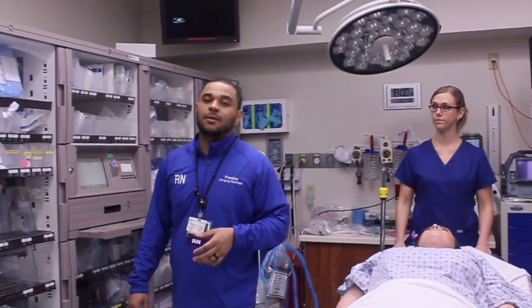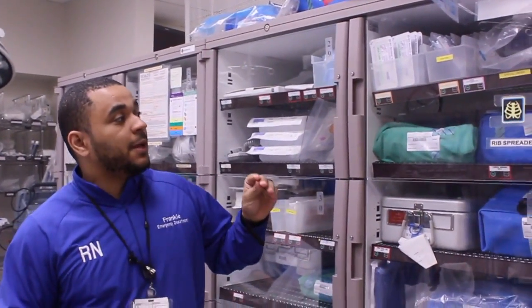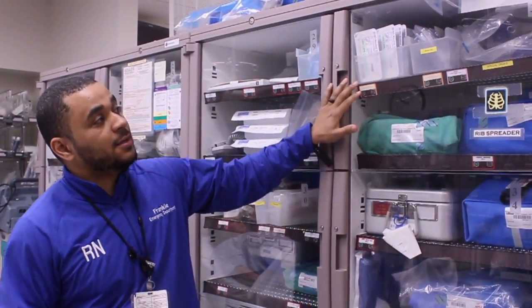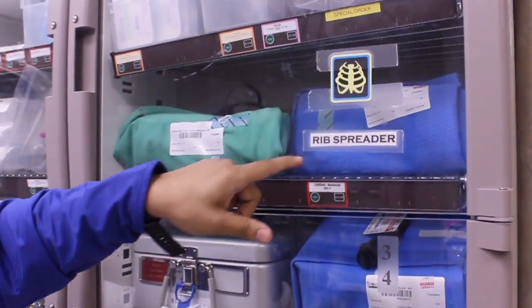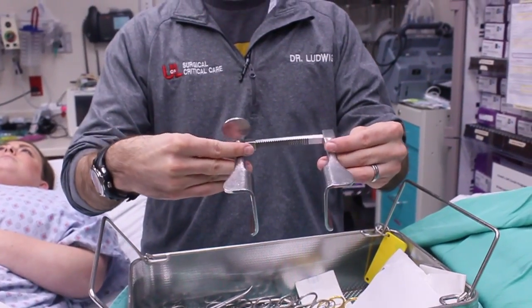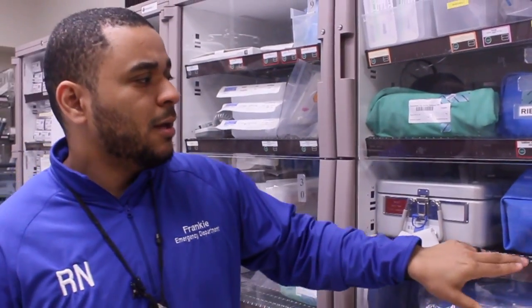Once the ED thoracotomy has been indicated by the physician, it's important that all PPE should be applied prior to initiation. The betadine and the suction Yankauer should be readily available at the head of the bed in case they encounter blood upon entering the thoracic cavity. The most important feature is getting the right tray, which is located in door 33 and is clearly identified by the rib spreader. Also, the internal defibrillator paddles are located in door 34, in case internal defibrillation is needed once in the thoracic cavity.